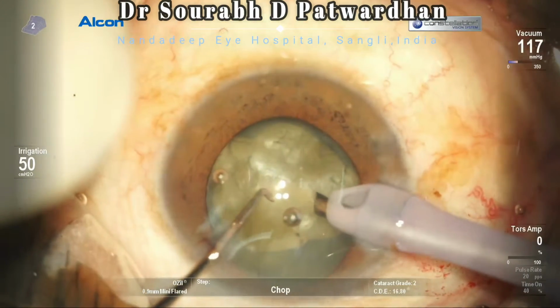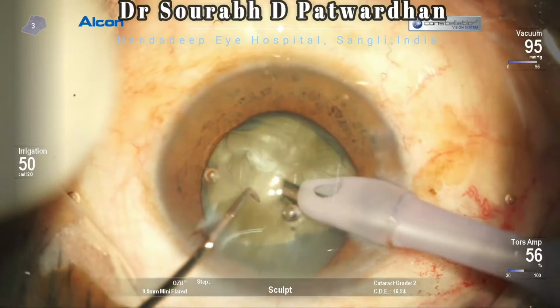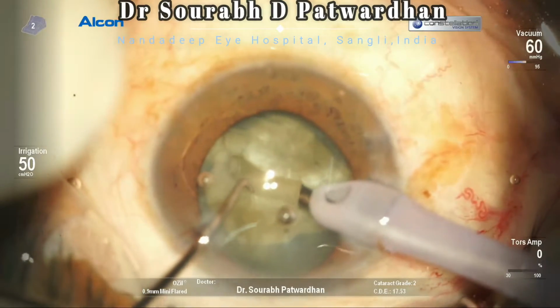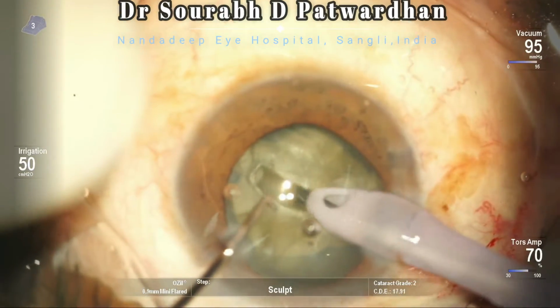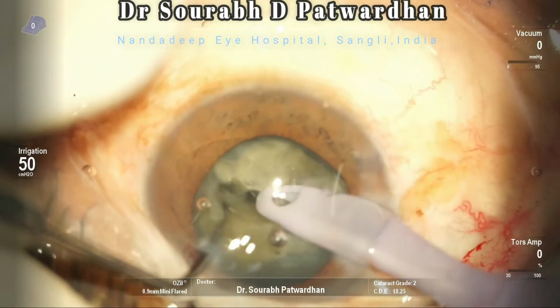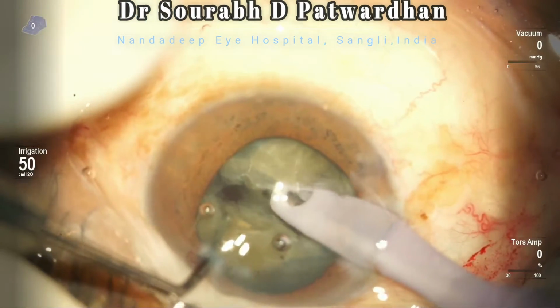To achieve that, I would like to show on the left side of the video, you can see the irrigation pressure. I have kept it at just 50 centimeters of water, which is roughly equivalent to 35 to 40 millimeters of mercury. So I am working at a very low IOP here.